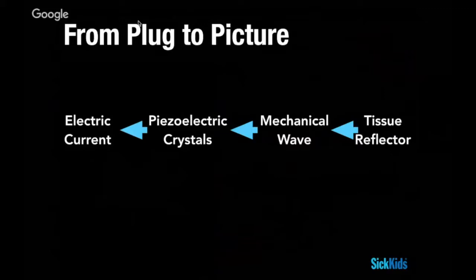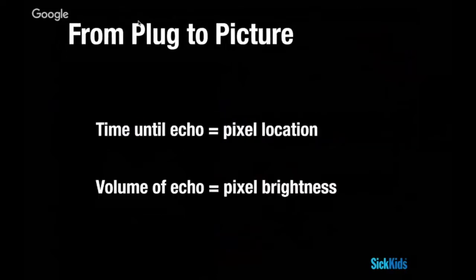And the very first ultrasound machines that used what was later given the term A mode, they didn't produce a visual picture for you. There was no grayscale, like, here's a picture of what's inside. They produced like an oscilloscope tracing of a dot that would show up, and you had to write it down on graph paper and say like, oh, I think that means there may be a stone. And there were early computers that tried to do some of this work. And then there's really the computer revolution of the 70s and early 80s that allowed such clear pictures to be generated from that information.